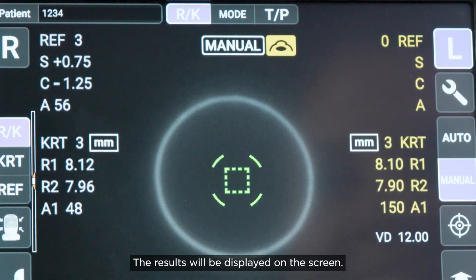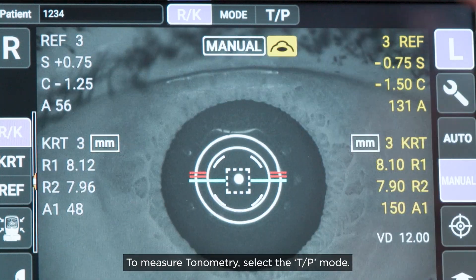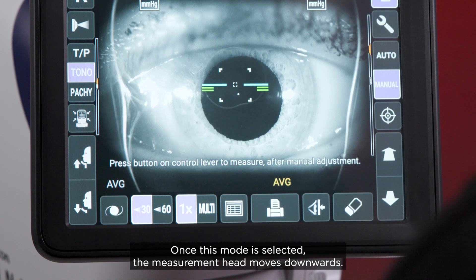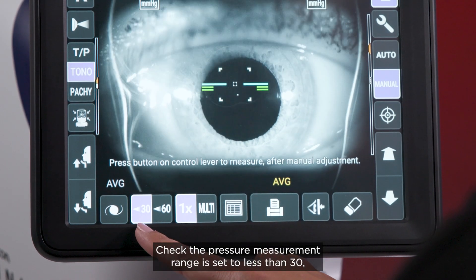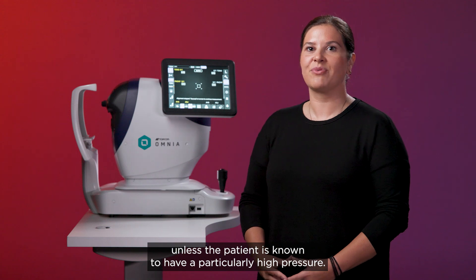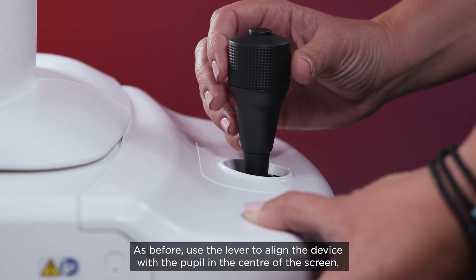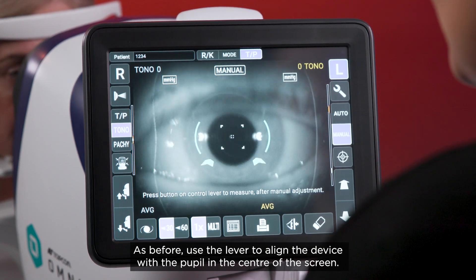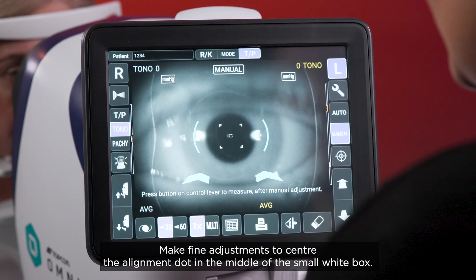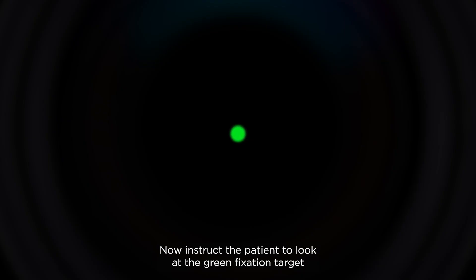The results will be displayed on the screen. To measure tonometry, select the TP mode. Once this mode is selected, the measurement head moves downwards. Check the pressure measurement range is set to less than 30, unless the patient is known to have a particularly high pressure. As before, use the lever to align the device with the pupil in the centre of the screen. Make fine adjustments to centre the alignment dot in the middle of the small white box. Now, instruct the patient to look at the green fixation target.